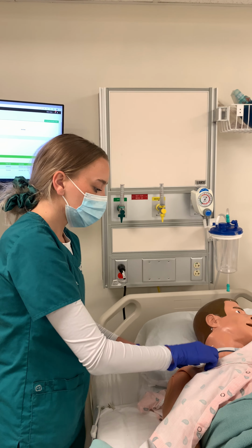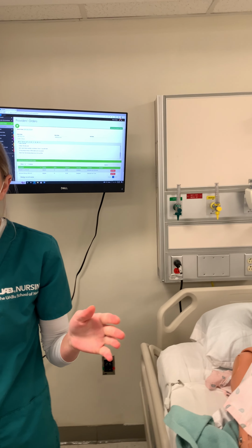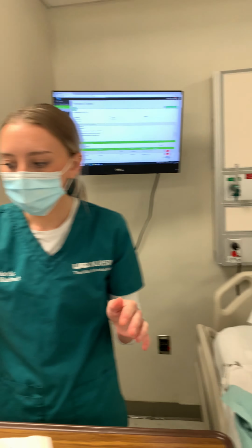At this time, I would just observe for any swelling, inflammation, or drainage. I'm going to go ahead and discard the supplies appropriately. Next, I'm going to go ahead and perform hand hygiene. All right, and I'm going to proceed to open up my sterile package using sterile technique. All right, I'm going to grab my sterile gloves and apply.